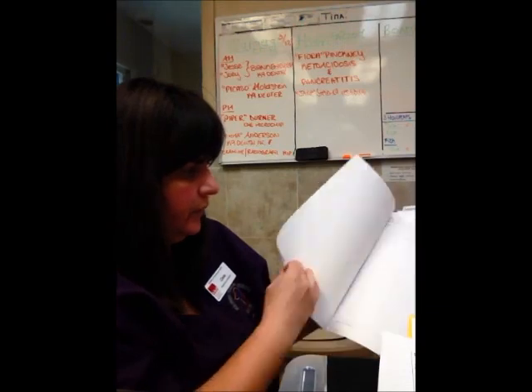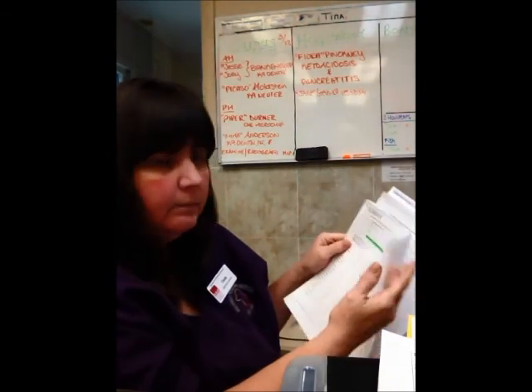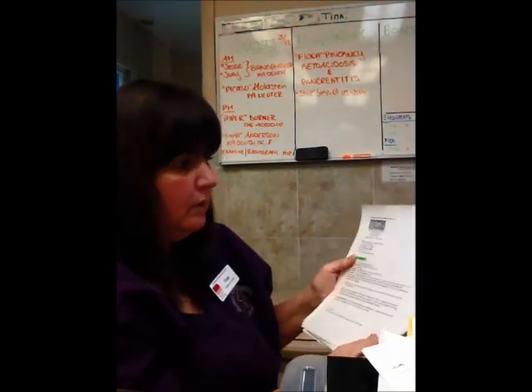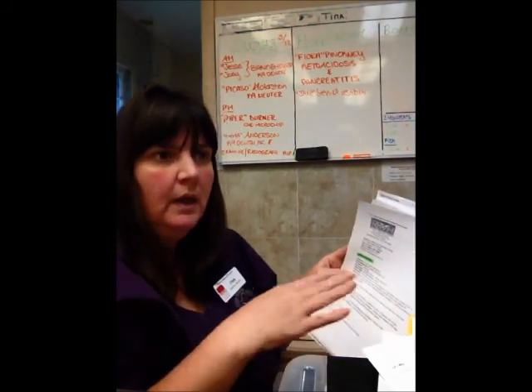So we look through their blood work and make sure that it's safe for them to go under anesthesia. If they have a heart murmur, or sometimes a specific breed, maybe a Boxer or a Cavalier King Charles, we might have them do an ECG report. So we might do a pre-anesthetic ECG. We use an AliveCor system, so we have an Apple iPad and a device that we place on the heart with the patient in right lateral recumbency. We get a readout onto the Apple iPad.